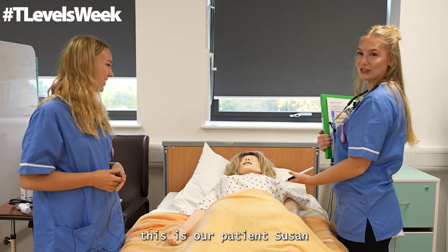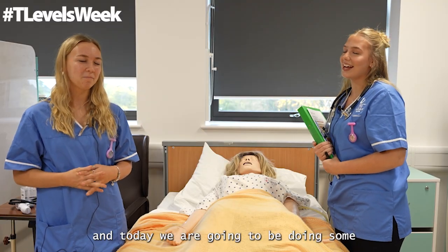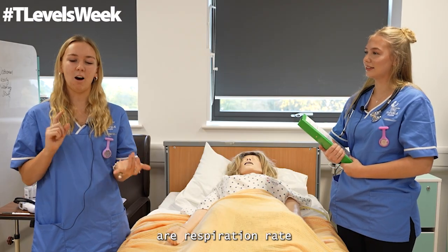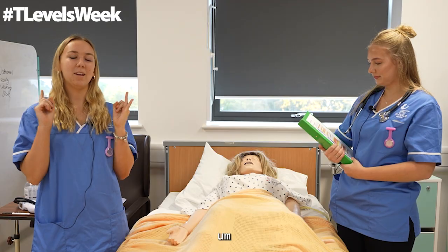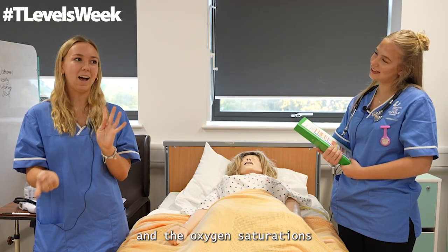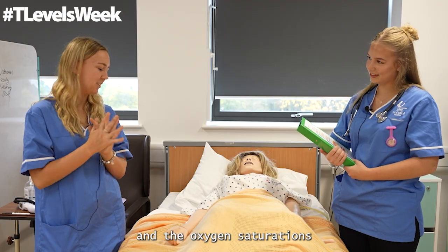This is our patient Susan. Susan's 46 years old and today we're going to be doing some observations on her. So the 5 observations we take in nursing are respiration rate, the blood pressure, temperature, pulse and the oxygen saturations.